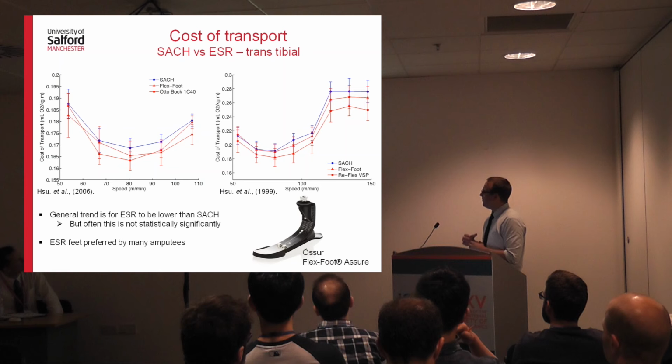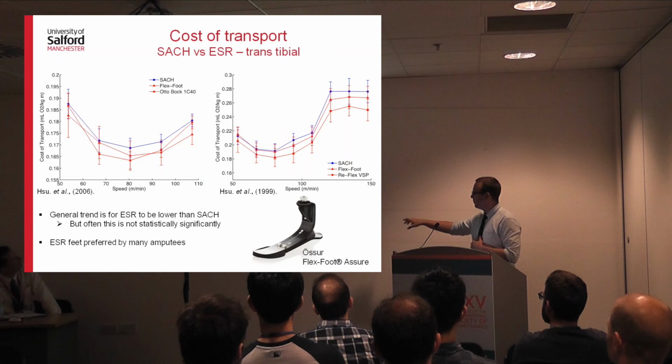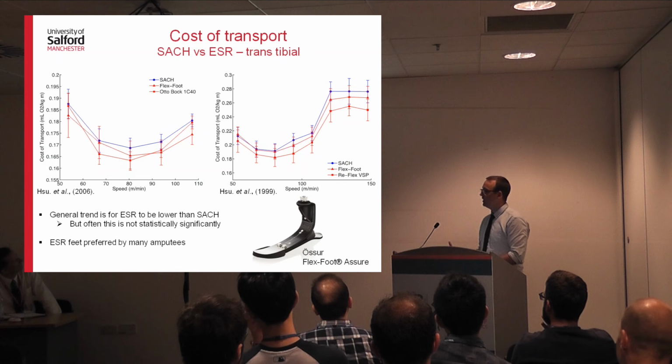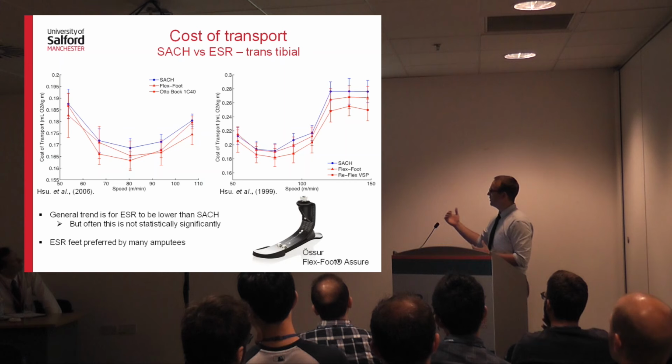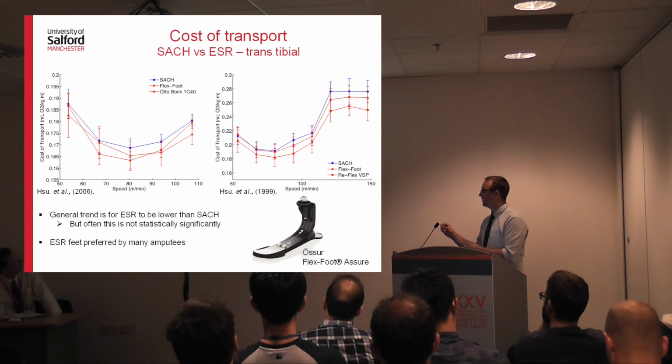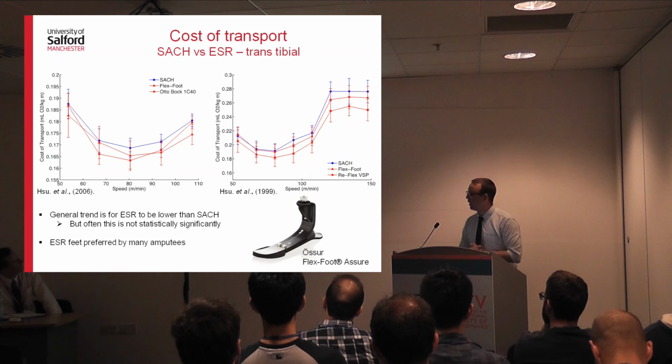An interesting aside, if you like, is that these ESR feet, like the one you see in the bottom right here, are preferred by amputees for subjective reasons. So they'll say things like, I get a reduction in the pain, they're more comfortable to walk with, they're easier to walk with, which is quite a subjective term. So that's just something to bear in mind while we talk about this. So even though we don't see any difference in the cost of transport, these feet are preferred by amputees, and I think actually by prosthetists as well. They prefer to prescribe this kind of foot over a more basic SACH foot.